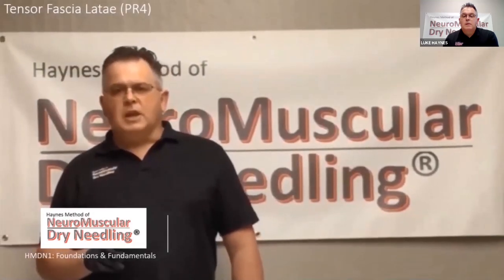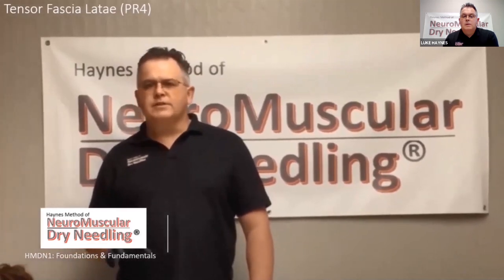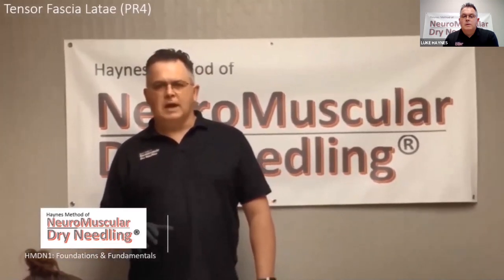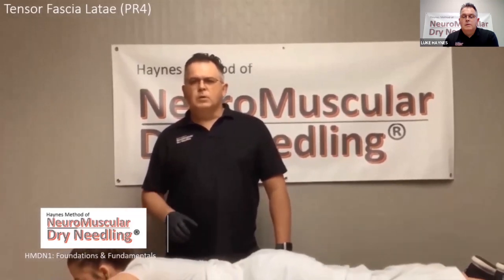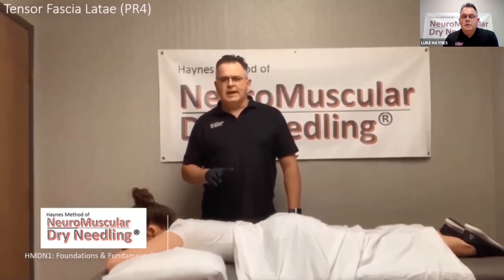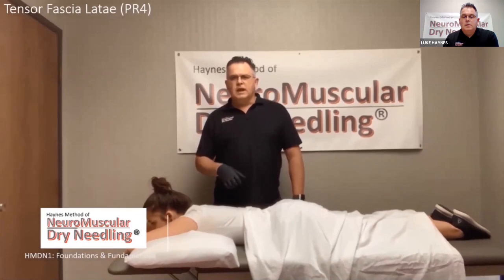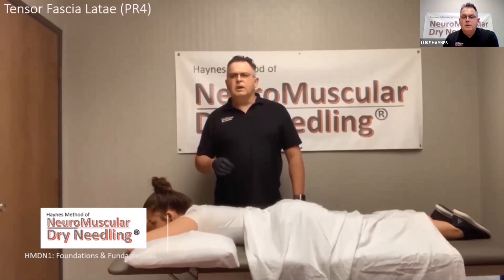For the tensor fascia lata, or the TFL, patient again is in the prone position. Needle length here is 30 to 40 millimeters, and there's no backdrop. We'll palpate the apex of the greater trochanter and the iliac crest. We should palpate the IT band along this path. We'll grasp the anterior aspect of the TFL with the fingers and the posterior aspect of the IT band with the thumb. At the midpoint between the 2 bony landmarks, we'll insert the needle and advance posterior to anterior, medial to slightly lateral towards the table, using your fingers as a backdrop to determine adequate depth.